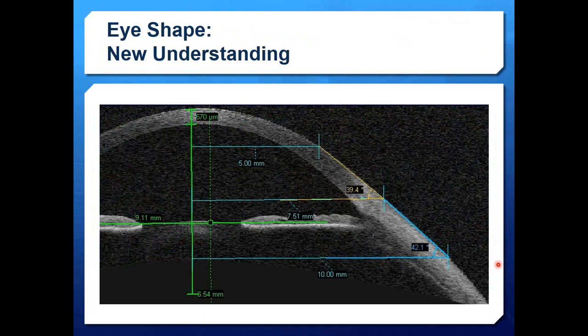Now, some of the things that might be helpful to understand prior to discussing the makeup of the ICD is what we know about the shape of the eye. And one of the studies that Patrick Caroline at Pacific University has led us to evaluate is, with OCT, what is the underlying shape that we actually land on with our scleral lens?